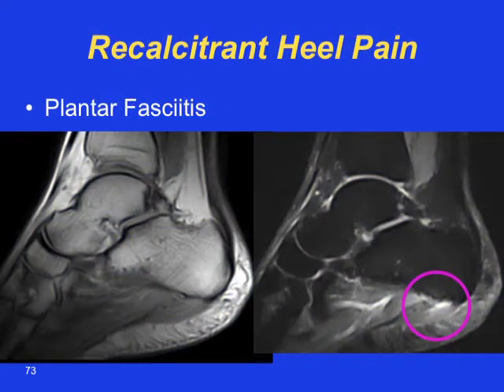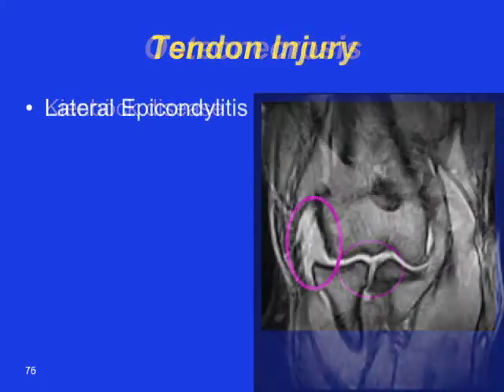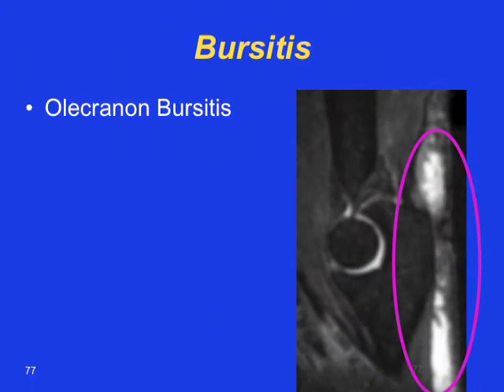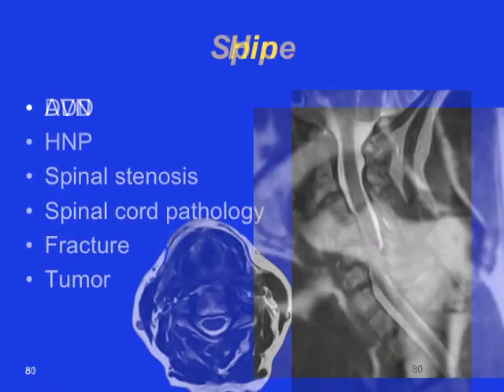So pretty much, on and on here, I'm showing you actually the meat and potatoes of why you would utilize an MRI in your practice rather than talking about rheumatoid arthritis, which is obviously the intellectual side of it, but the truth of the matter is, it is what I'm showing you here now in a relatively rapid fashion. The real reason why having an MRI in your practice may make a lot of sense. Obviously, you can see very nice pictures of the hip and spine over there.